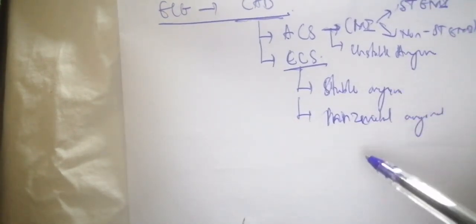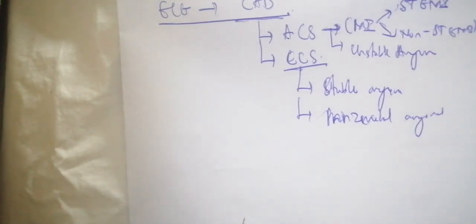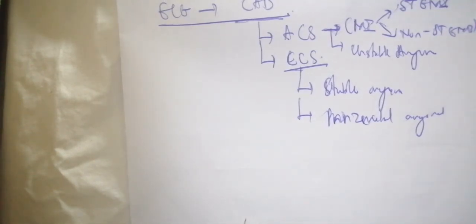So those are the different elements that you have to visualize. You have stable angina and Prinzmetal angina, which are associated with chronic coronary syndromes. Now, we need to know that each of them has a different presentation on the ECG, which I'm going to tell you.